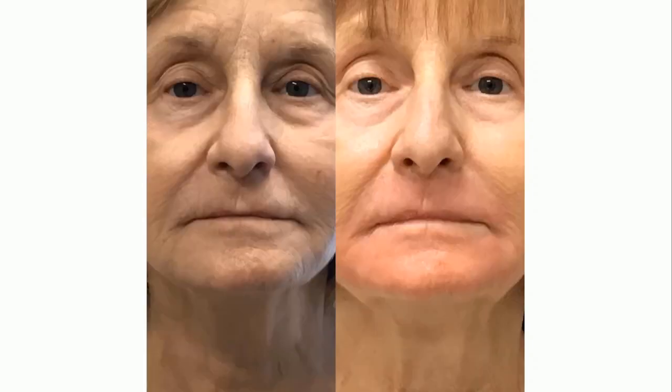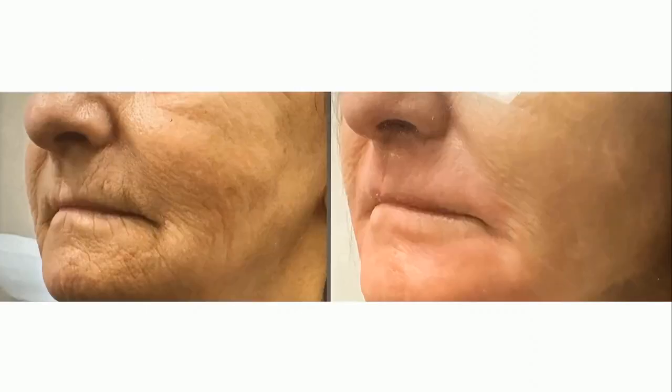And then just a couple of examples of combination therapy. So this is a patient I've done multiple treatments on over the years. Neuromodulator, filler, we had done fractional CO2 probably 3 years ago, and more recently she came to me and was like, I just want a little more improvement. So here I did 5 passes of fully ablative erbium on her, and this is her 18 days after treatment. They do have some residual post-treatment erythema even after the 2-week healing period, but I feel the results are quite impressive, and there's just a side view.